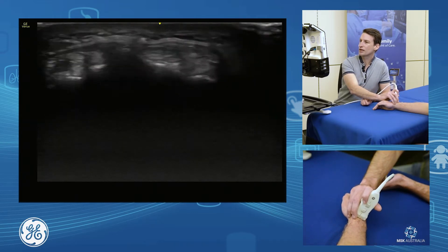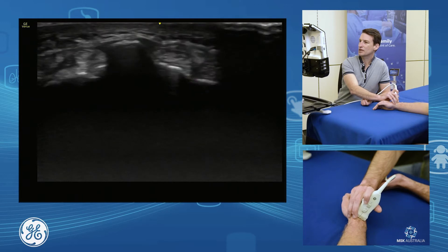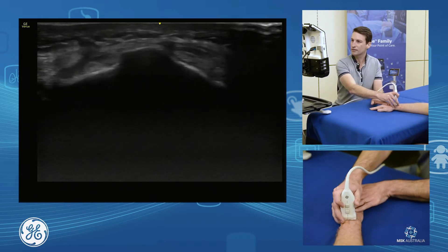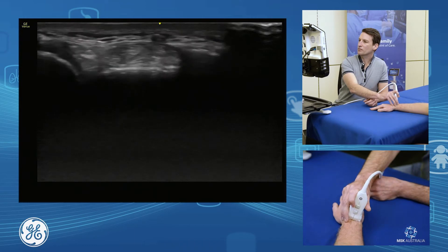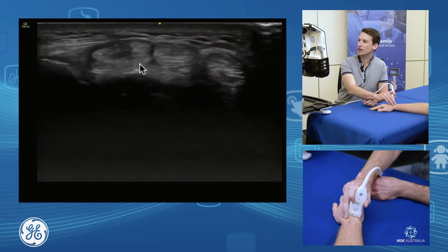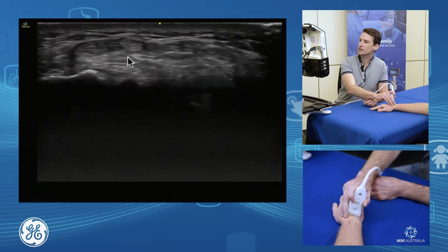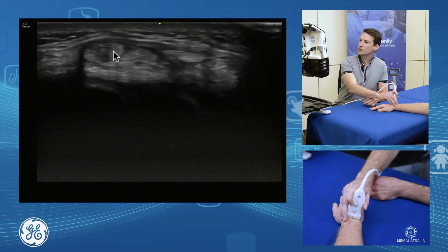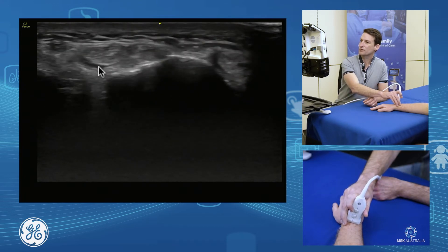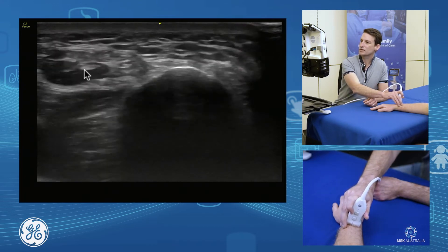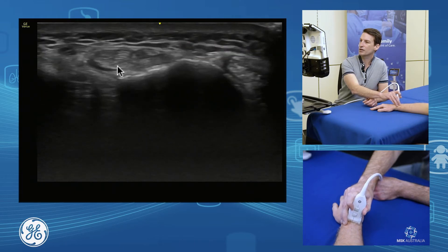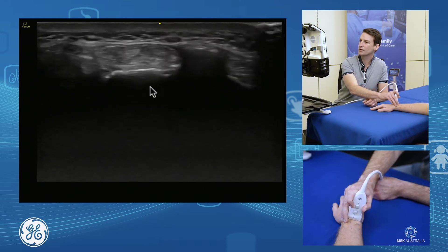As we come down again, we can see our Lister's tubercle as our landmark, and we'll just drop the wrist flat. Moving over from compartment three to compartment four, which consists of our extensor digitorum communis and extensor indicis running through there. We can see our extensor indicis coming up and under the extensor digitorum communis.